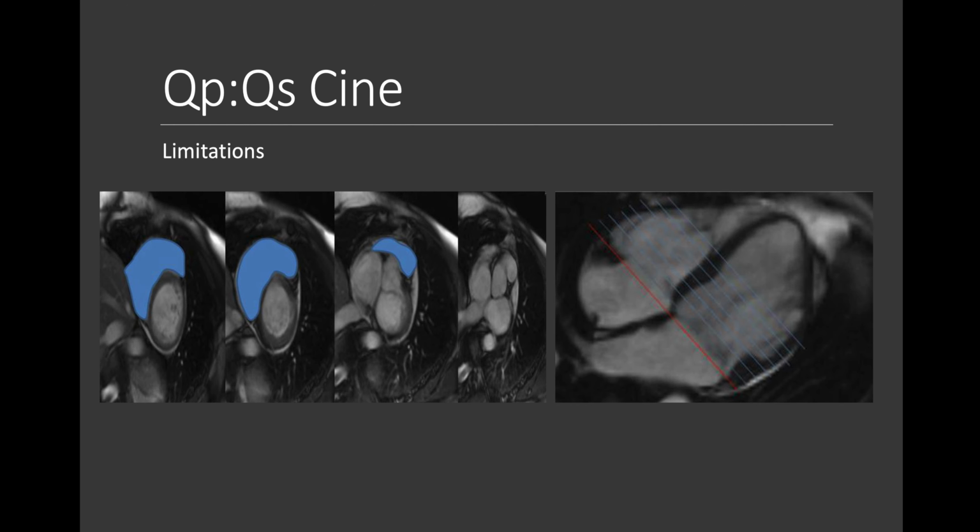then you are allowed to measure it. The right ventricle stroke volume has to be equal to the left ventricle stroke volume. If not, the only possibilities are that the contouring is wrong, there is a shunt, or there is a regurgitation, and then further evaluation might be needed.